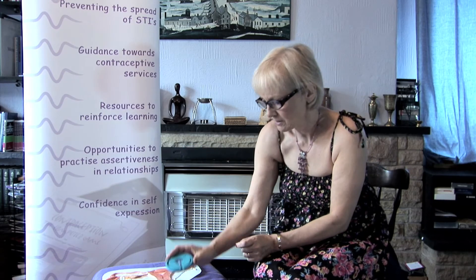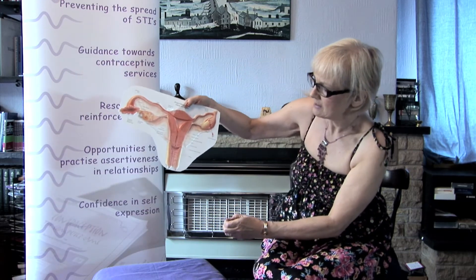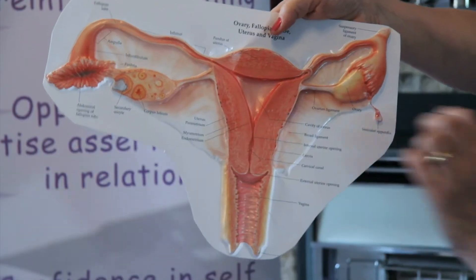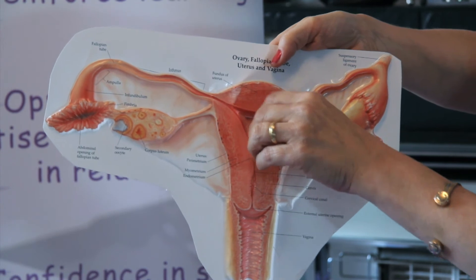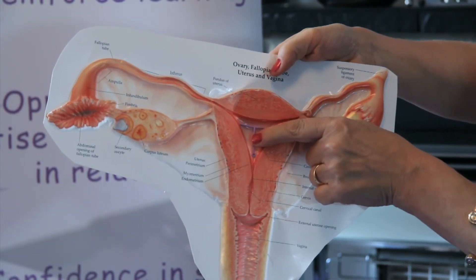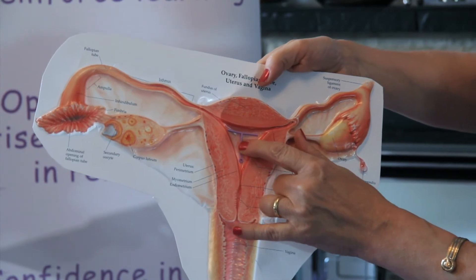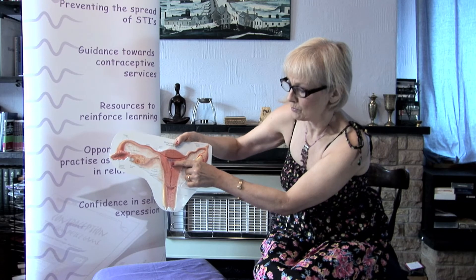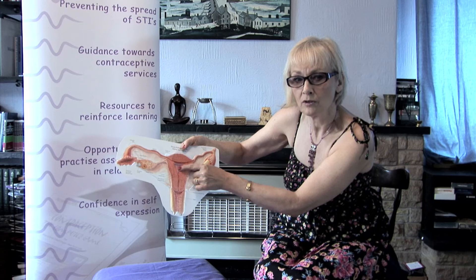I'll just show you whereabouts it fits in the uterus. A healthcare professional — a trained doctor or family planning nurse — fits it inside the uterus like that, and the string hangs just outside of the neck of the womb. It can stay in for five years, no problem at all.